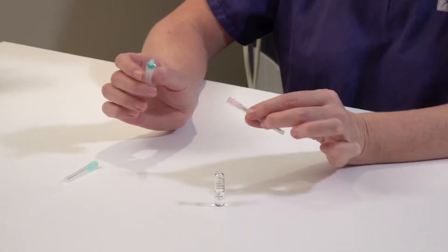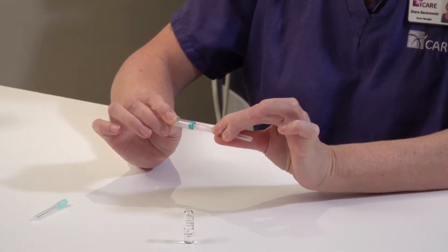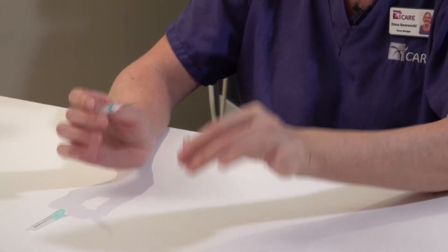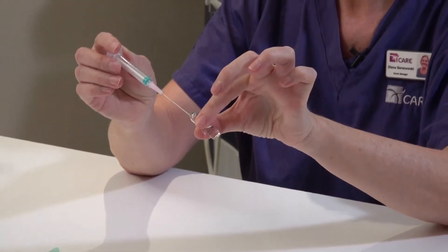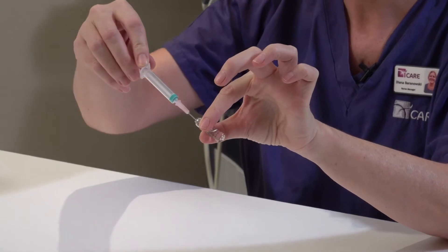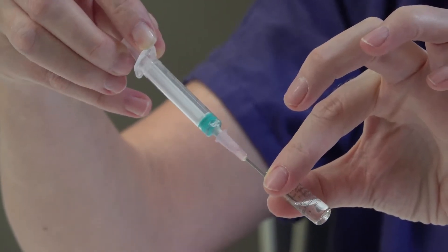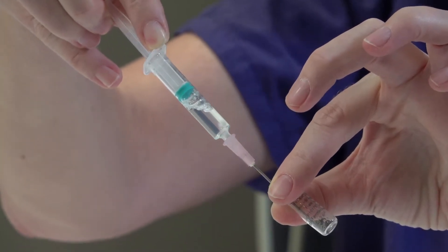Using your drawing up needle, attach it firmly to your syringe. Place the needle into the bottom of the ampoule and draw up the fluid into the syringe. Withdraw the needle from the ampoule.